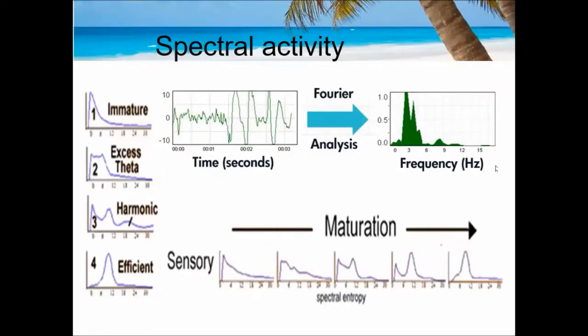Okay, once we get the signal at the Laplacian level and then at the Brodmann level, we find the components. We average it up. It's all about the central tendencies. And the spectral plots, I've talked about before, we're going to talk about again today. It's all about what condition you're recording. If you're recording eyes open, you're going to get something different. Recording a math test, a reading test, some kind of condition, playing a video game, watching a movie, you're going to get something different from this plot right here. This is the eyes closed resting condition.